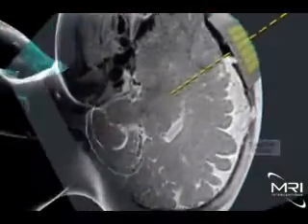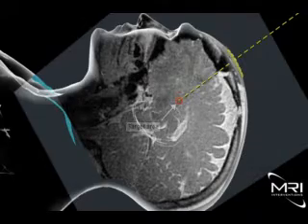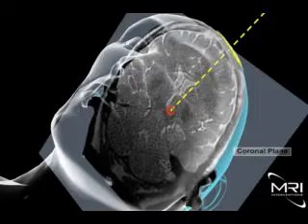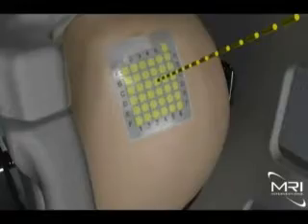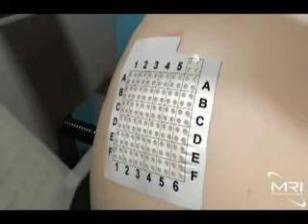The entry point of the planned trajectory is identified on the patient via the smart grid. The ClearPoint software recognizes where the planned trajectory passes through the MR-visible smart grid and identifies the specific coordinates to the physician. In this example, the coordinates are C4. The top layer of the smart grid is then peeled back and the coordinates are used to guide the surgeon in marking the location of the entry point in the patient's skull.